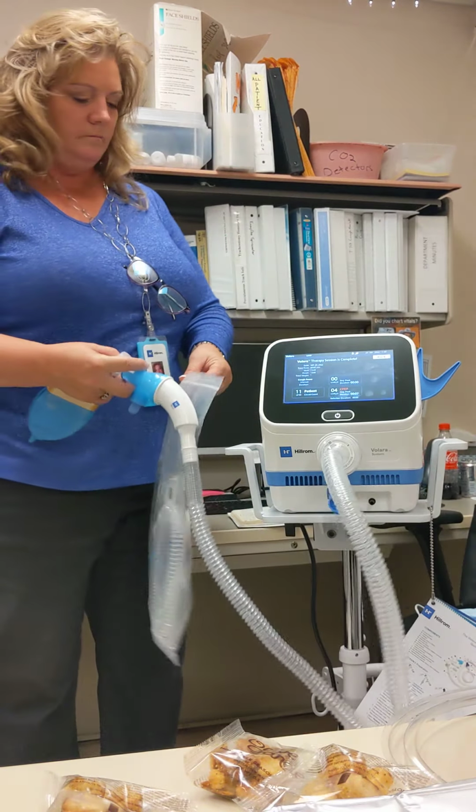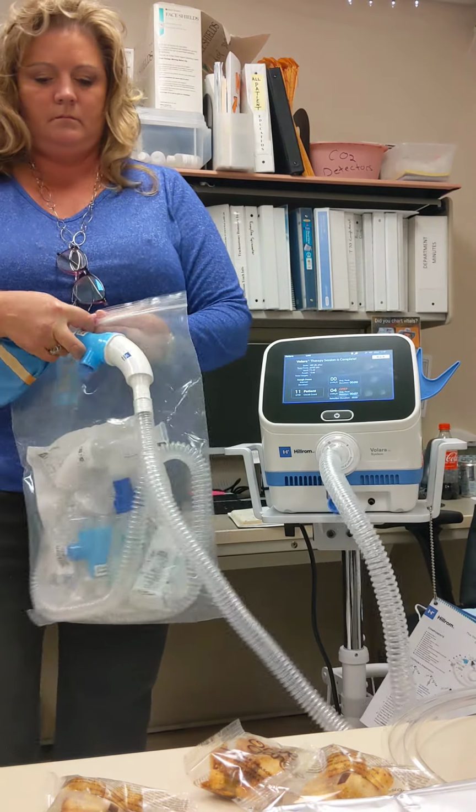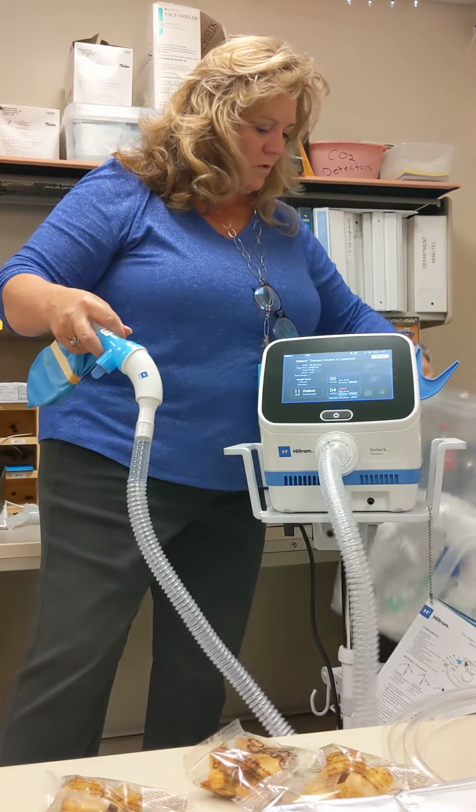The other thing too, when you're giving a treatment to a patient, have them every so many breaths, 4 or 5 breaths, take a deeper breath in, deeper breath out. Same kind of thing.